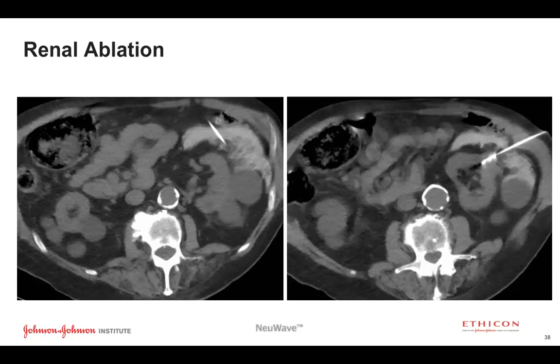And one of the nice things with microwave ablation in the kidney is this cautery effect of the thermal ablation, which gives you a little additional peace of mind as well. So I have the lowest threshold to use microwave if patients are on anticoagulation or antiplatelet therapy, for example. So that's one of the benefits.